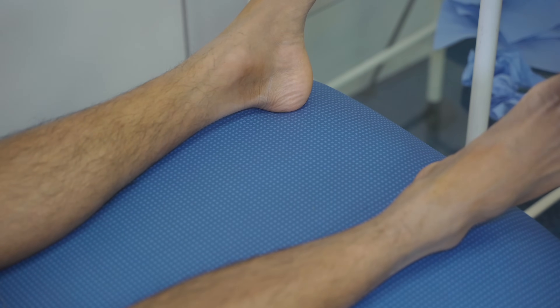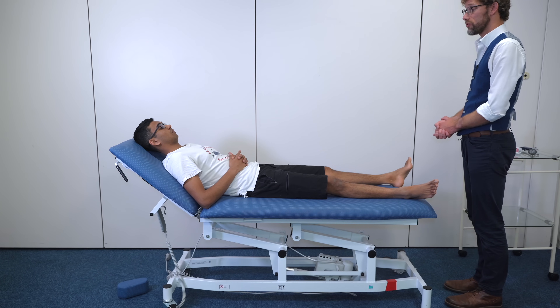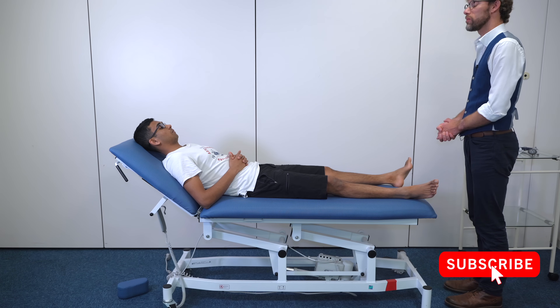So that completes our examination. The pressures in your legs are slightly higher than the pressures in your arms, so you'll have an ABPI of greater than one, which shows you've got good vessels in your legs. Do you have any questions for myself? No. Super. Thank you very much. Take care.